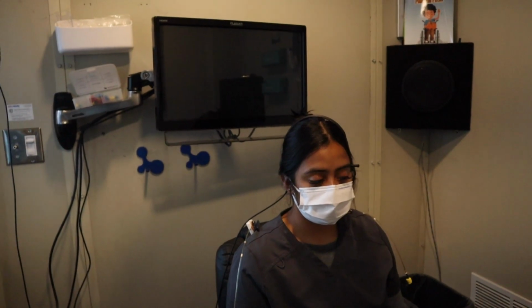We leave the headphones in, and then we do word recognition scores. The purpose of word recognition scores, as opposed to speech reception threshold, where we're trying to find the softest, is with word recognition, we're often trying to find the most comfortable level for the patient to repeat words back successfully. So we might try them at different volumes, but essentially we're trying to make the patient at their comfortable listening level and have them repeat words.